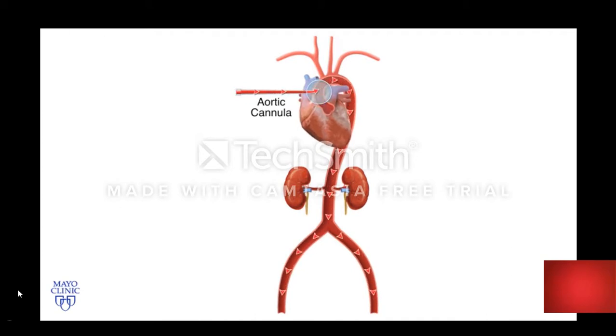In this scenario, blood sampled from most regions of the body would generally have a similar composition. The exception may be the coronary arteries, which, due to their proximal takeoff from the ascending aorta, may be primarily perfused by blood exiting the left ventricle, and not by blood leaving the ECMO cannula. The perfusion of the coronary arteries with adequately oxygenated blood can be problematic during VA ECMO support, even with centrally placed cannulas.